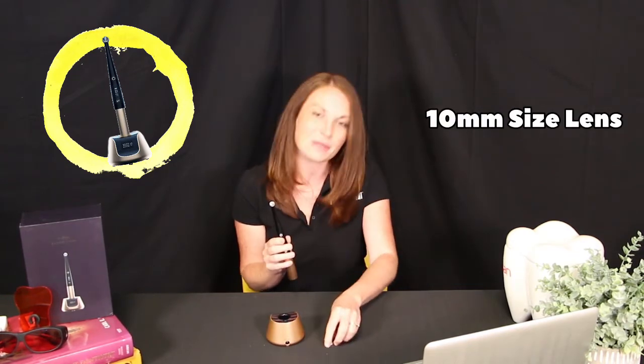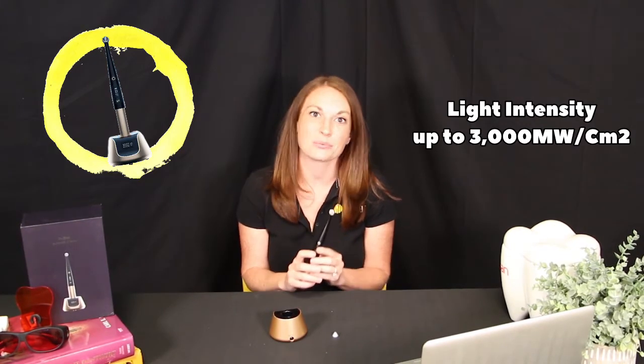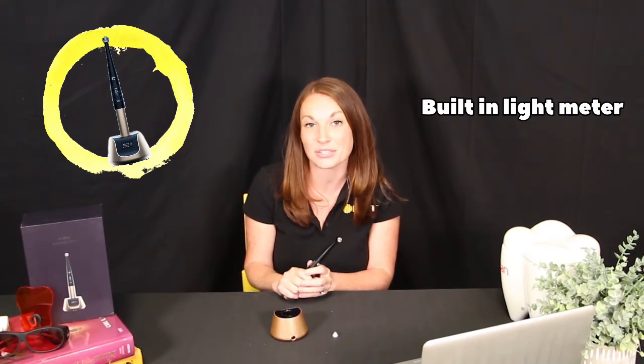It does come with a magnetic contact tip and it also has seven different modes, including a check mode. The O-Star also has a powerful uniform beam and the light intensity up to 3000. The charging base has a built-in light meter to measure your light intensity too.